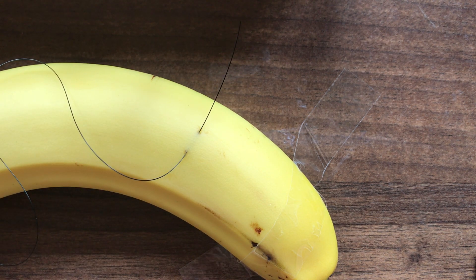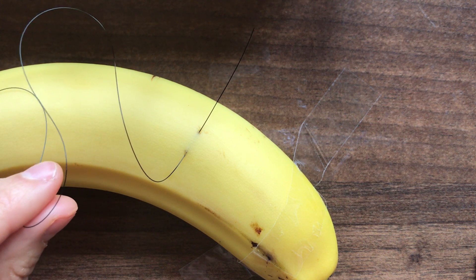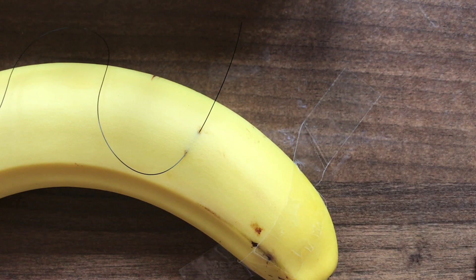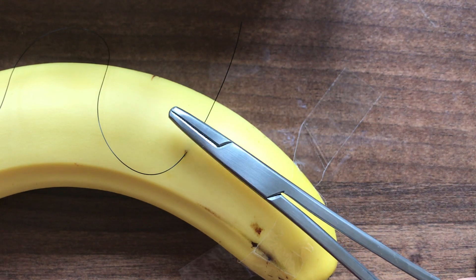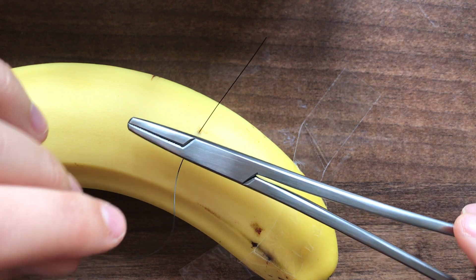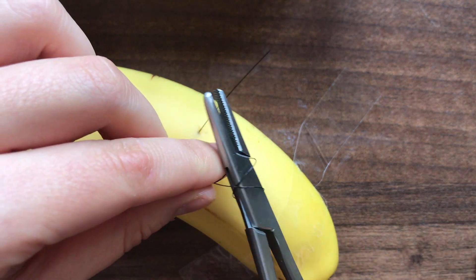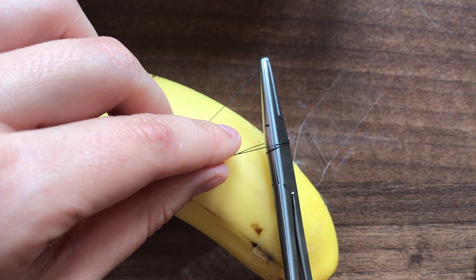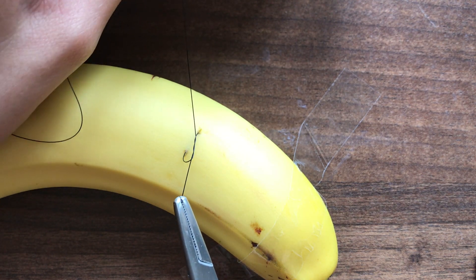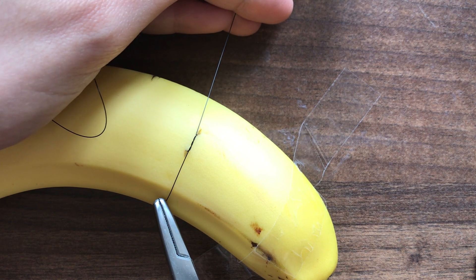To do an instrument tie, you have the long end over here where your needle is, and then you have the shorter end just there. Take your needle holder and get it in the middle. The first throw is two threads essentially — you go around the needle holder once, round again, then hold the tip of the short end and pull it over. You get that lovely flat knot, the same as with the hand ties.